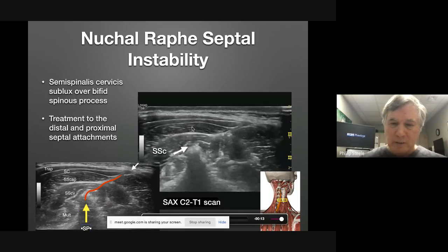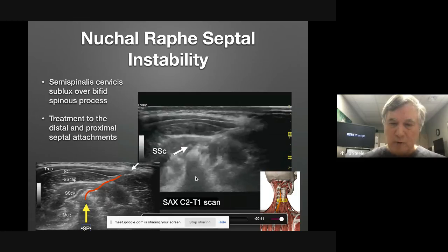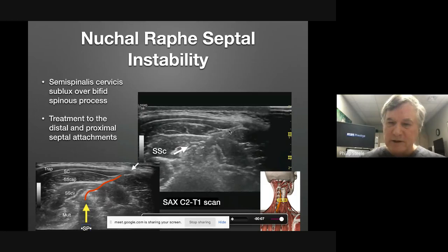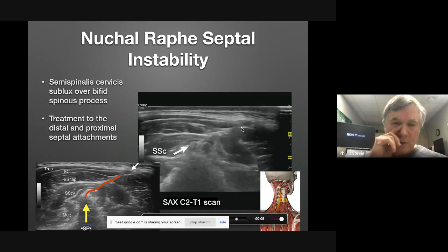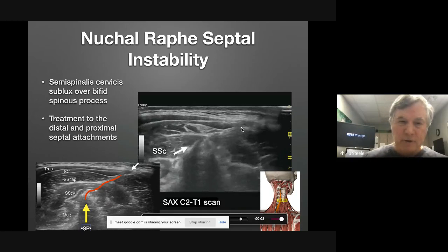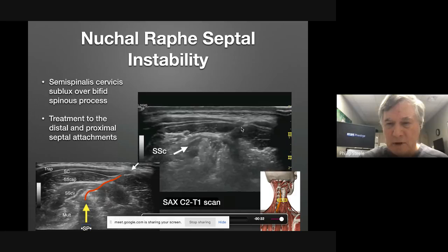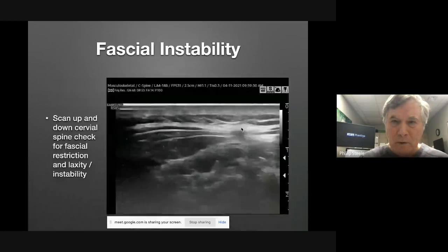With traditional Prolo technique, where you're going down to bone and going in between, you've missed all of your targets that you normally want to hit. So with sonoanatomy, you're going to identify areas that you didn't realize were a problem.